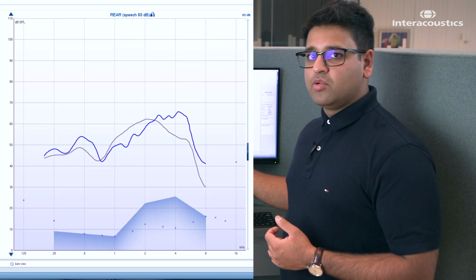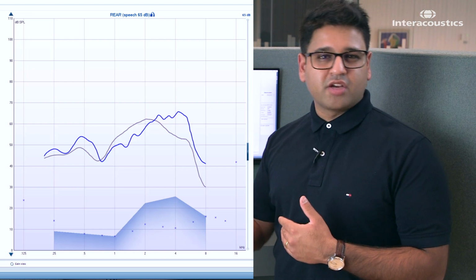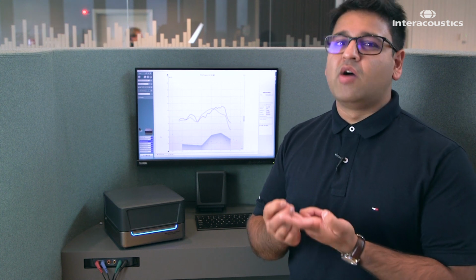So here we have an example of the hearing aid that's been matched to the previous hearing aid's audibility, and we can also, on a second program, match the hearing aid to a third-party fitting algorithm like NAL or DSL, and this will give them the best of both worlds: first of all, the audibility that they prefer, but on their second program the correct audibility that will help them to rehabilitate and hear speech and language better.